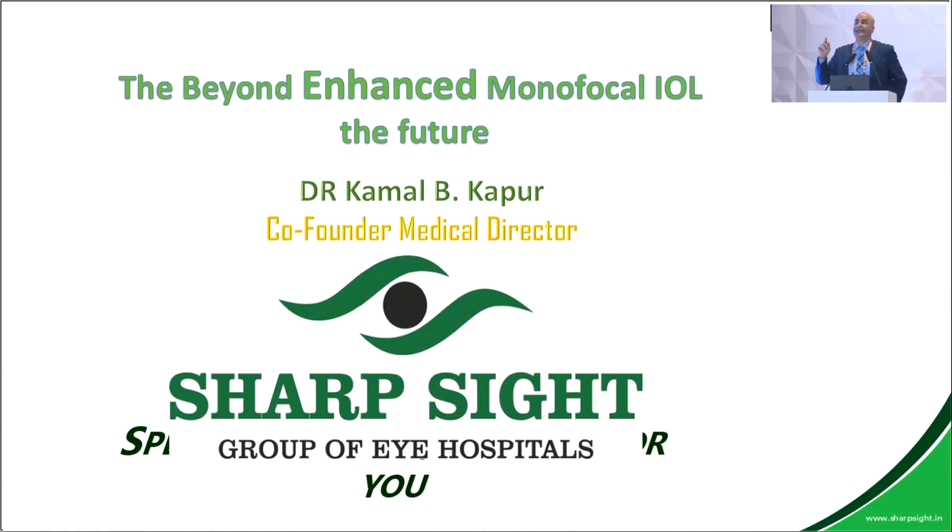Number two, when you're operating a keratoconus patient, this can be very, very tricky. Look for an angle more than 45 in case you're planning a high vault. When you're doing a toric patient, plan a higher vault, because if this lens rotates, you could be in trouble. A monofocal lens, if it rotates, doesn't matter.